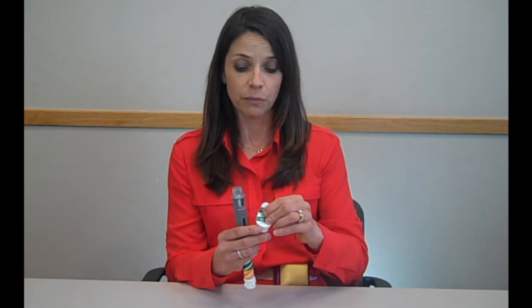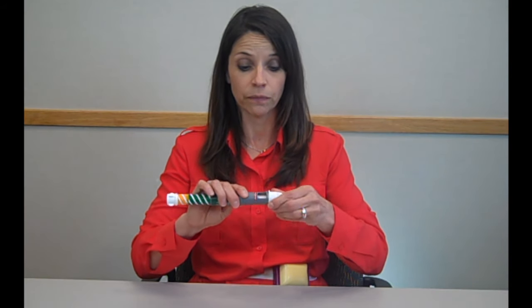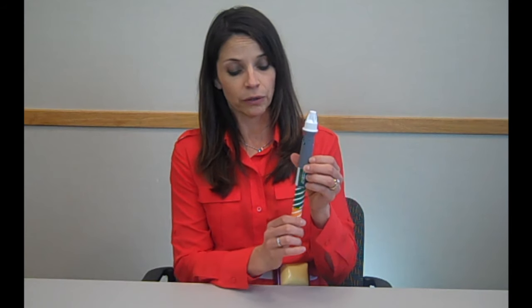To do this, we're going to place the needle onto the top of the pen by placing it straight on and twisting until it is secure. You can leave the outer cap on at this point. Next, to mix, we're going to twist and follow the directions on the green label until you hear a click and you no longer see the green.